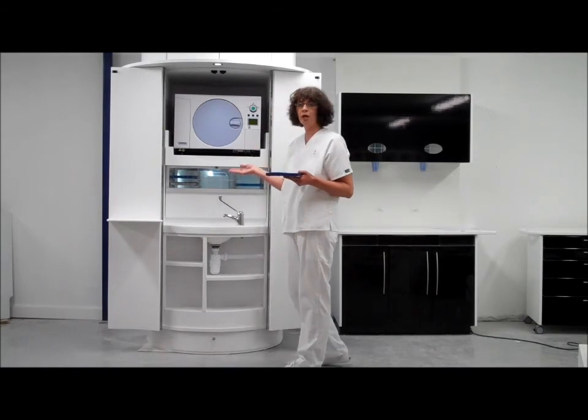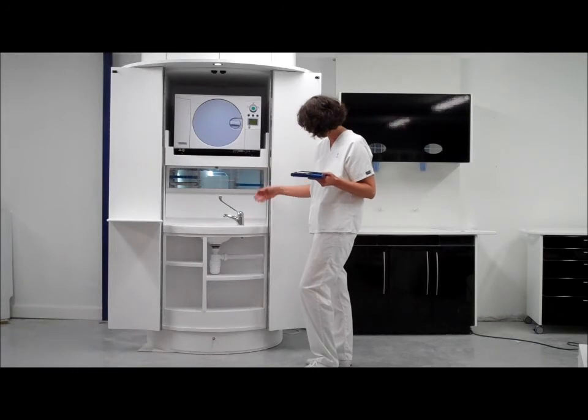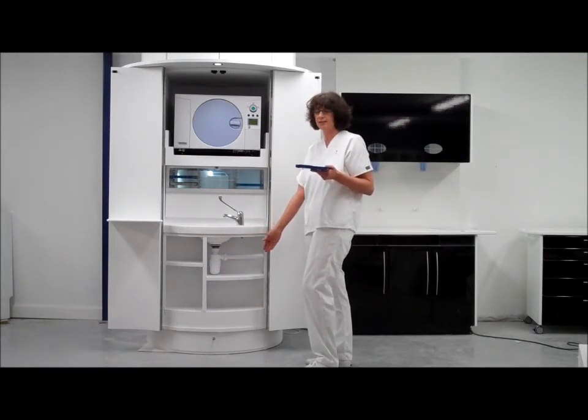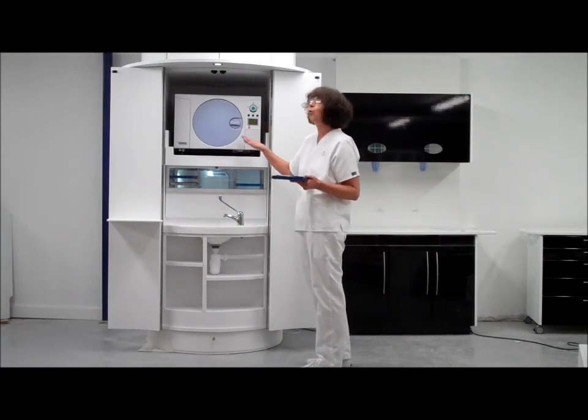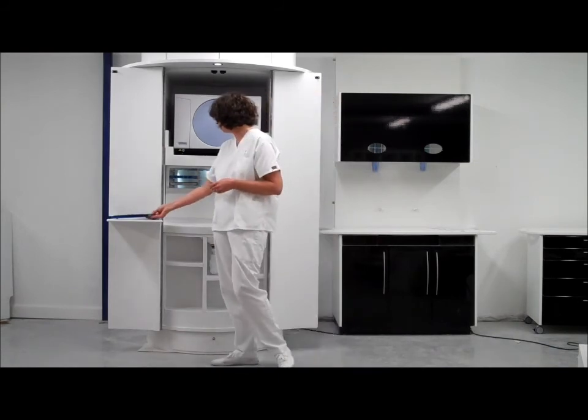Now, as you know, there are some codes that require instruments to be bagged prior to sterilisation, and there is an area at the bottom to house bags of various sizes. So one would either bag your instruments at this stage and put them in the autoclave, or autoclave them and then bag them. There is also a set-down area here.